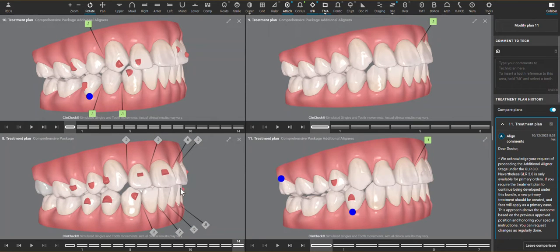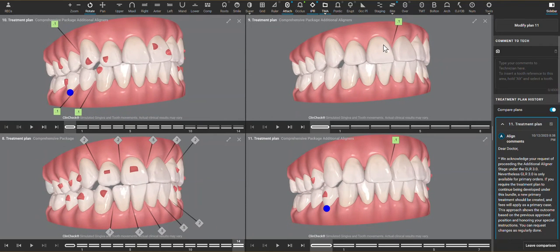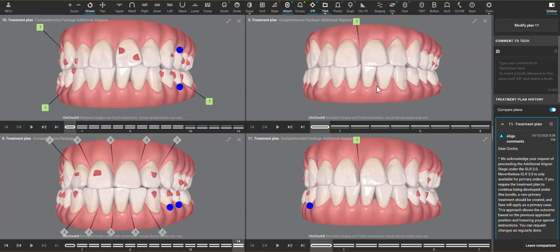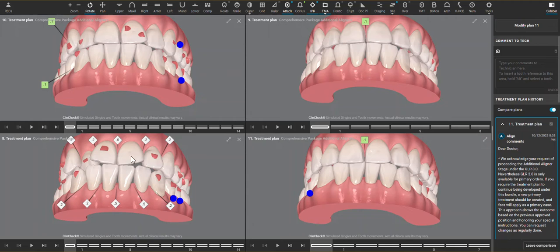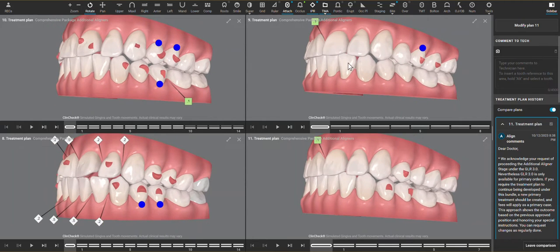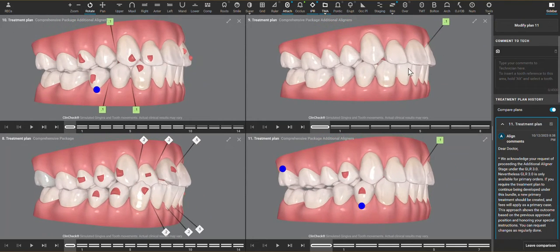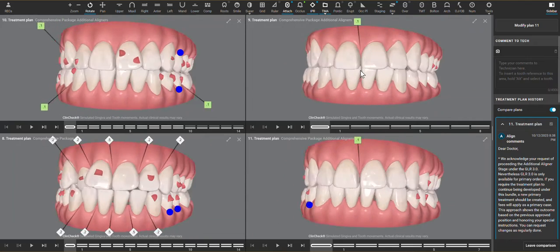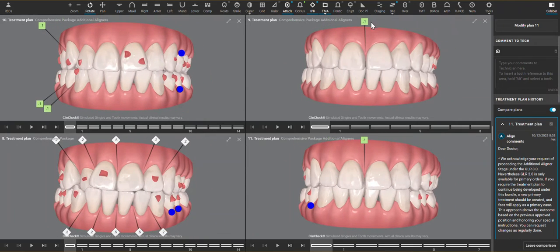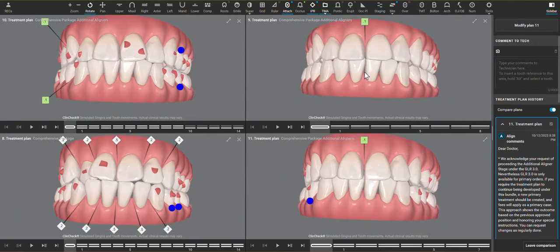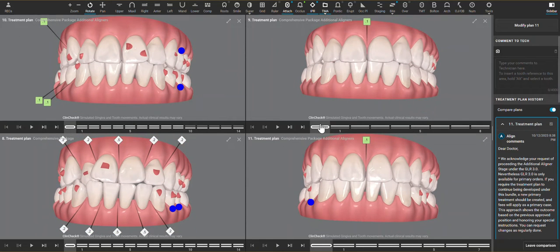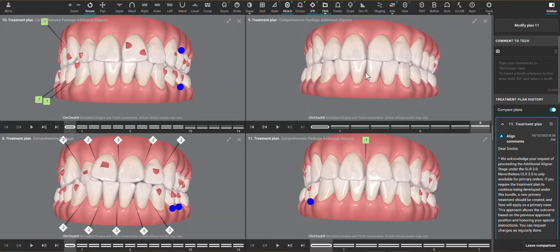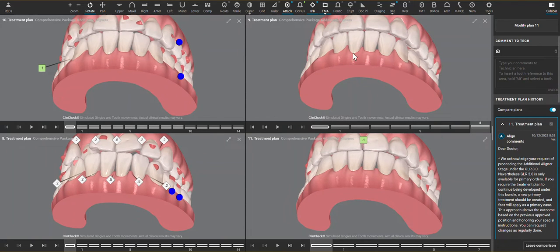Then we go to the next treatment plan which is here. So a huge improvement from where the patient started with these rotations, and overall pretty good occlusal scheme, just an open contact between the centrals. This ClinCheck is meant to close that contact and looks straightforward enough.